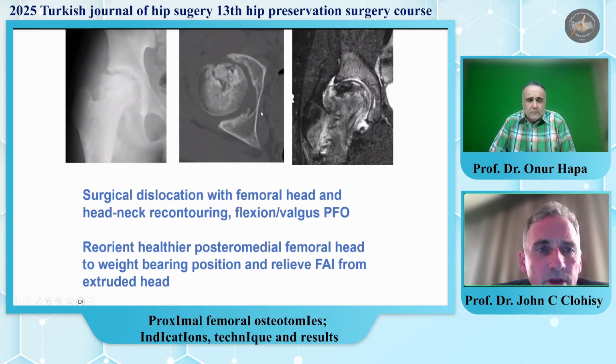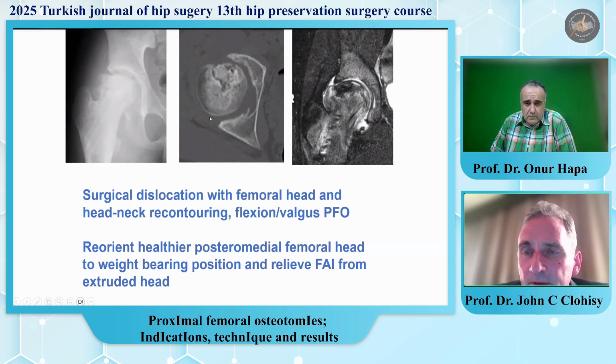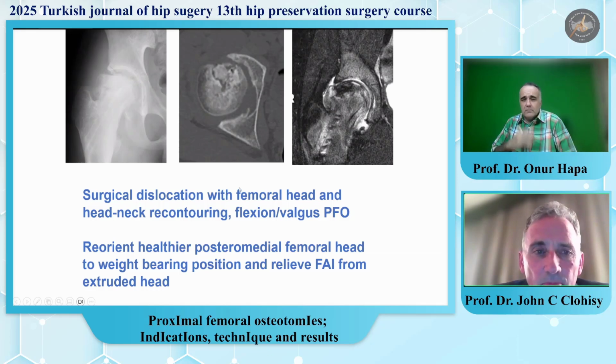Here are some more imaging studies. So you see the AP X-ray. This is the MRI, or the CT scan, which shows relatively healthy posterior medial femoral head. And then the MR shows a lot of edema and whatnot. But again, it looks like the medial head is reasonable.